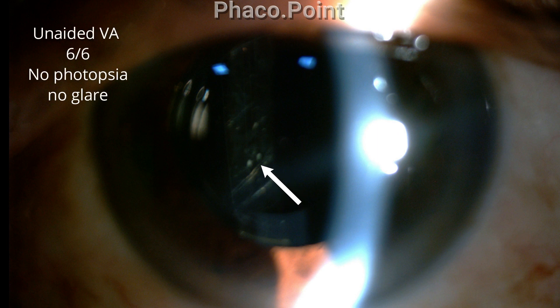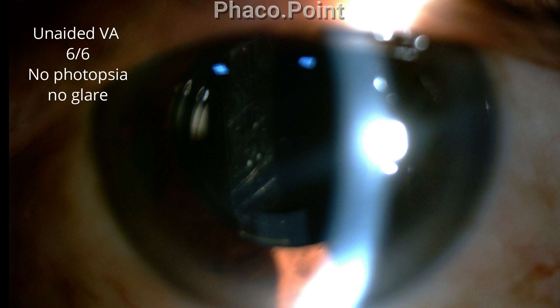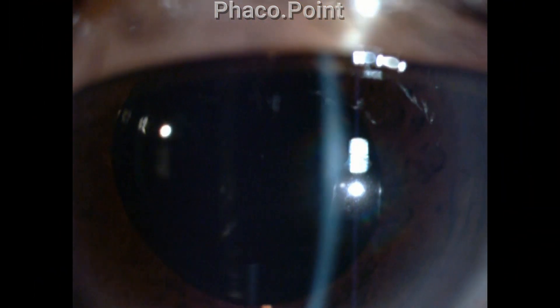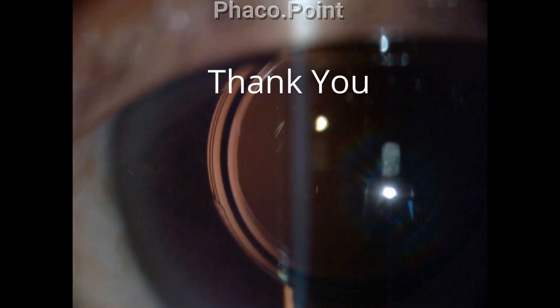This patient also had at the end of two weeks a 6/6 vision with no photopsia or glare. In conclusion, small lens fragments or lens matter seen in the Berger space can largely be left alone and observed. They generally will not incite an inflammatory response, nor will they induce cystoid macular edema. I thank you for your attention.